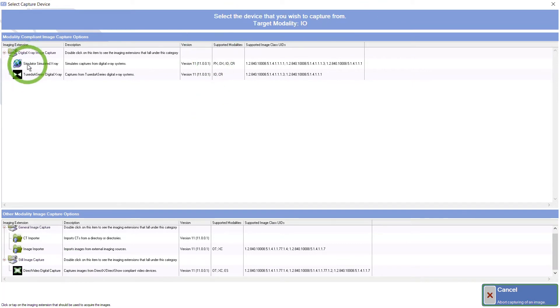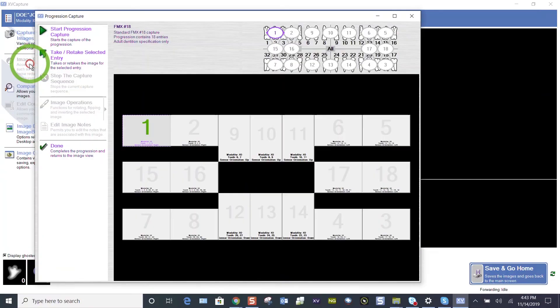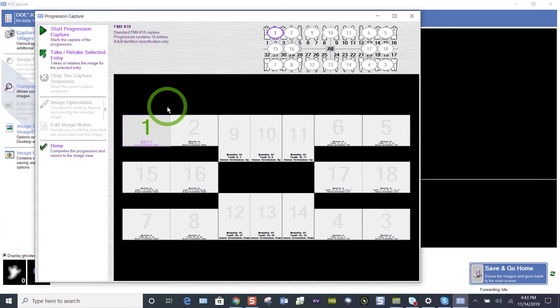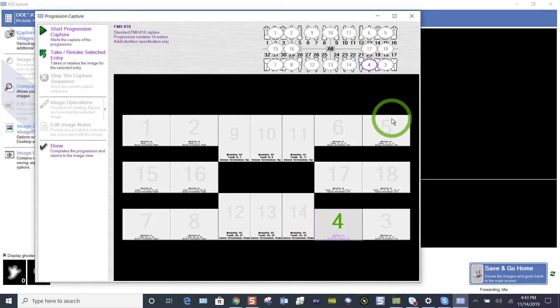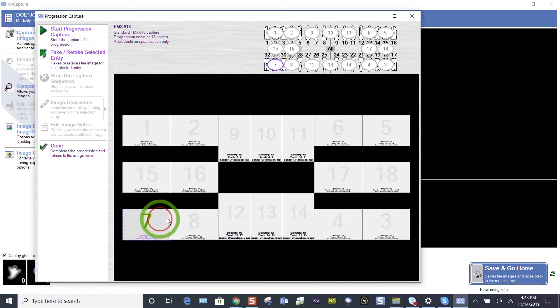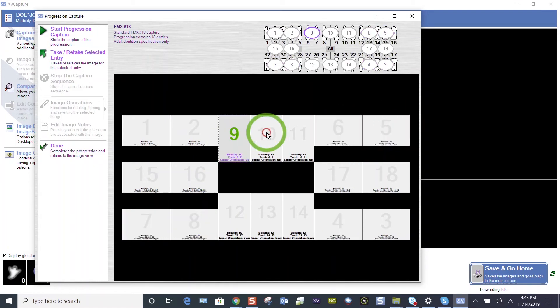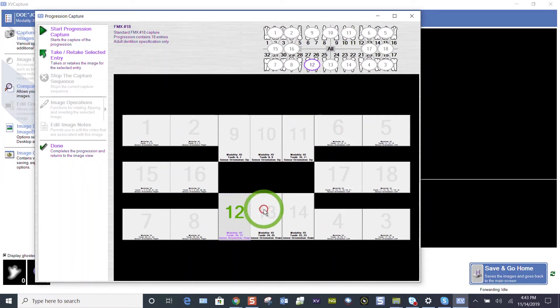My device is a simulator that simulates x-rays. And we're here. This is the most tried and true as far as time efficiency in taking an FMX 18. Starting on the upper right, you see the numbers on the tile. It's going to move in that numerical order, and then anteriors, and it takes the bite wings last.